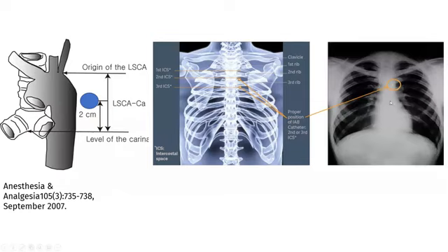Now, where do you position the balloon pump? This is where you should position it. You see the carina on the X-ray, and you position it under fluoro above the carina. Typically, you should position it about 2 centimeters above the carina, and below the aortic arch, definitely below the aortic arch. The aim is to end up below that left subclavian. And ideally, it has to be above the renal arteries, which typically are around L2, the second lumbar. So we can tell by the ribs, below the last rib, this is L1, this is L2. So we try to aim to have the balloon pump above L2.